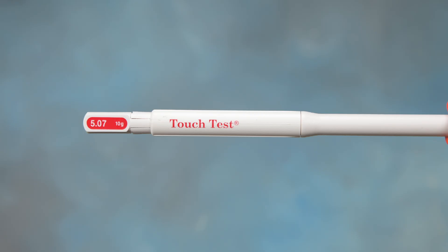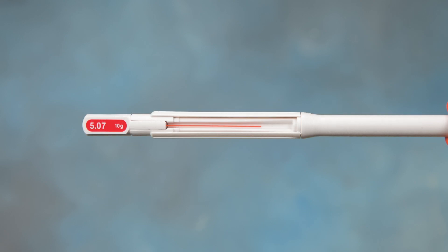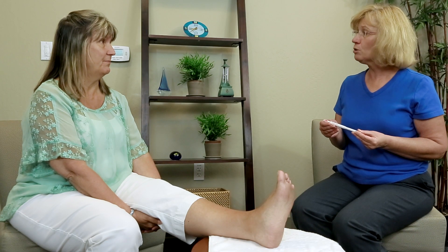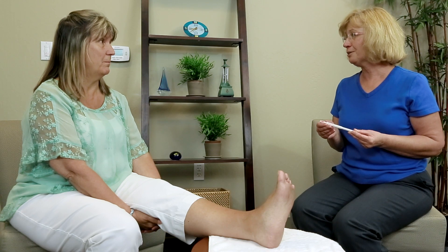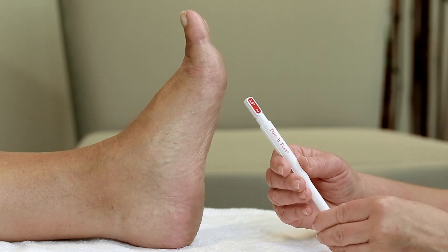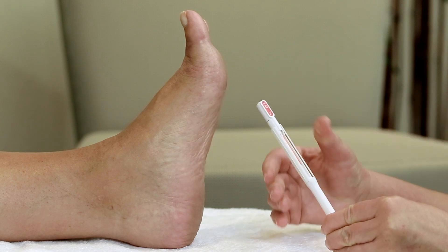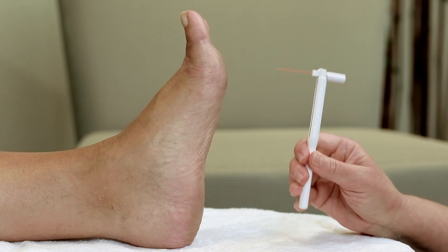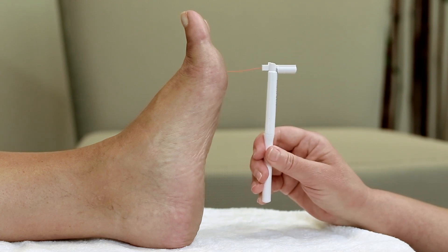Using the 5.07 for testing the foot is a painless test. Have a helper do the testing on both of your feet. You need to close your eyes and respond yes or no when you feel the pressure being applied. The helper places the monofilament perpendicular to the skin with pressure applied until it bends, for approximately one second.